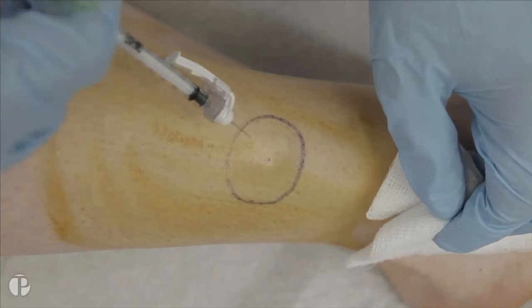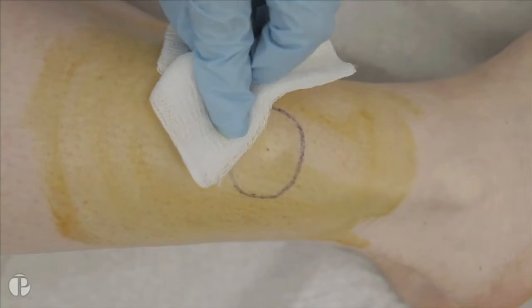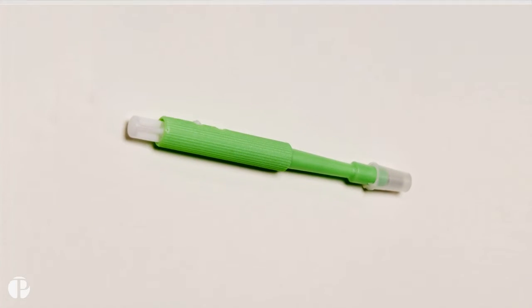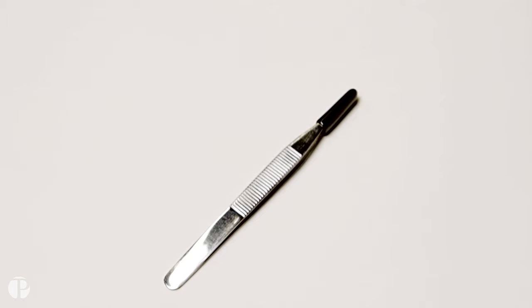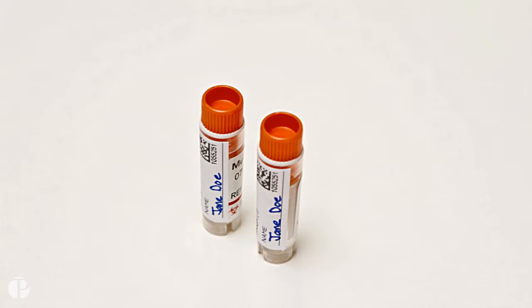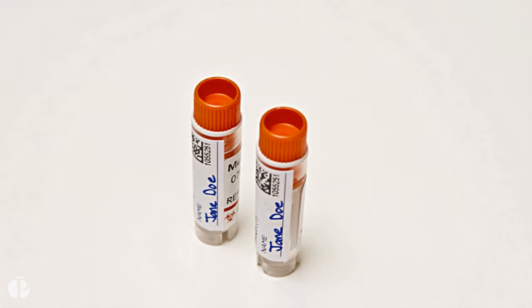While waiting for the injected area to numb, cover the patient's leg with a surgical draping. The next step will require the punch tool, scissors, forceps, and the appropriate number of specimen vials. Keep in mind that you will need one labeled vial per sample.